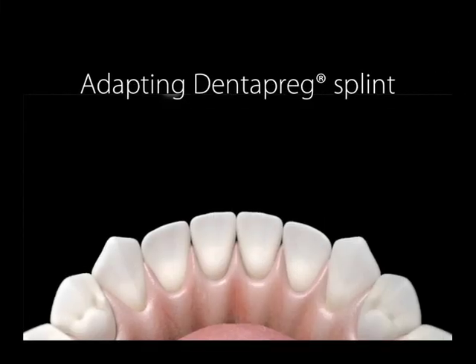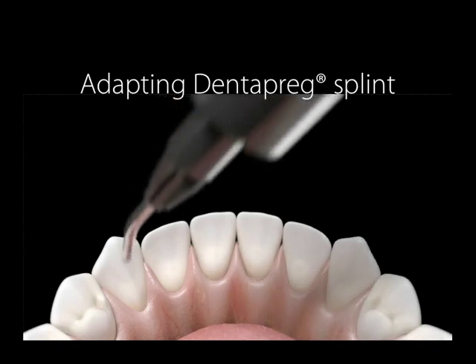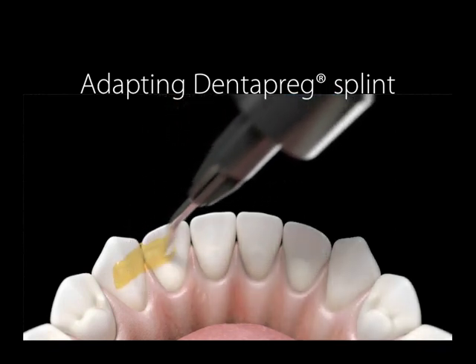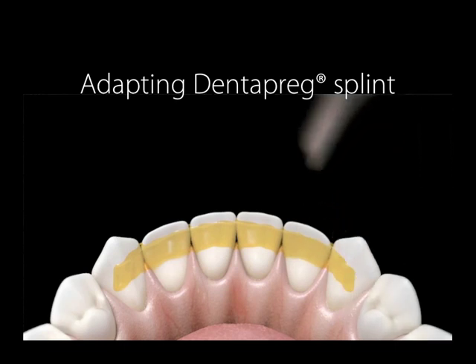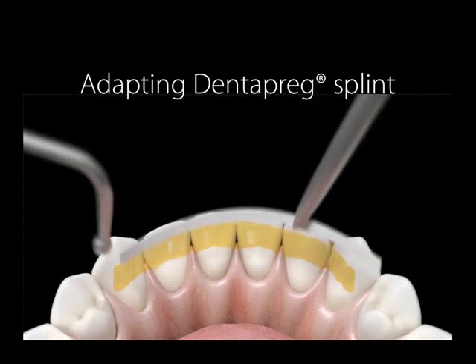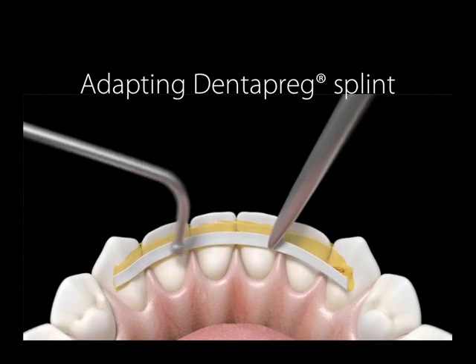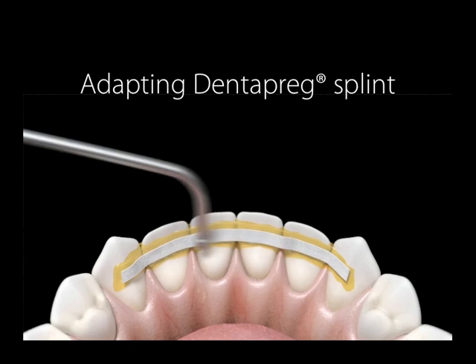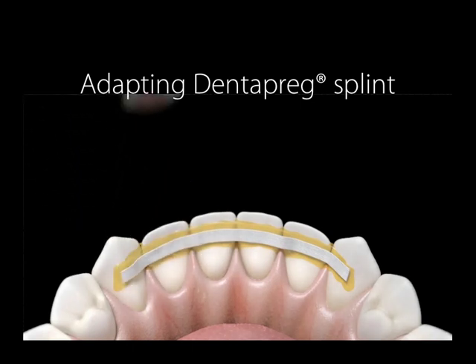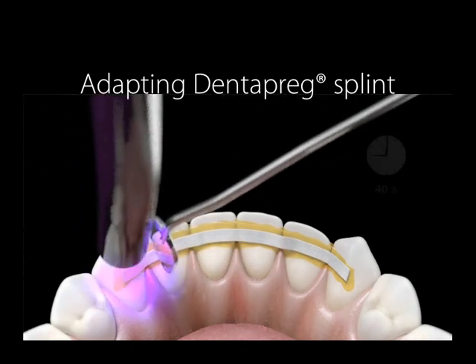Here, you will briefly see how easy it is to adapt a Dentopreg splint. On the surface of the prepared teeth, you apply a thin layer of flowable composite. Then you insert the strip and easily adapt it to the desired position. Then you light cure the strip, going tooth by tooth, around 40 seconds per tooth.